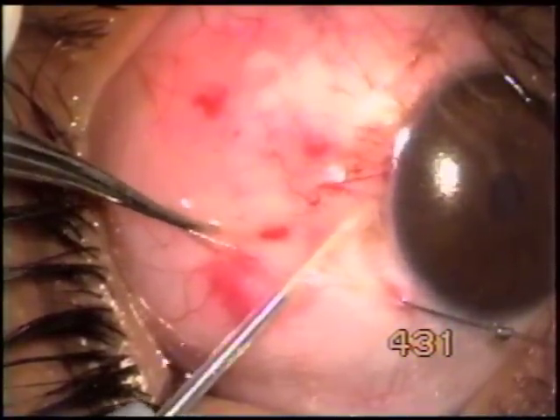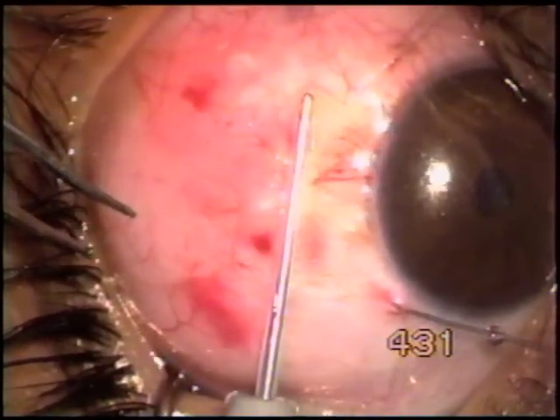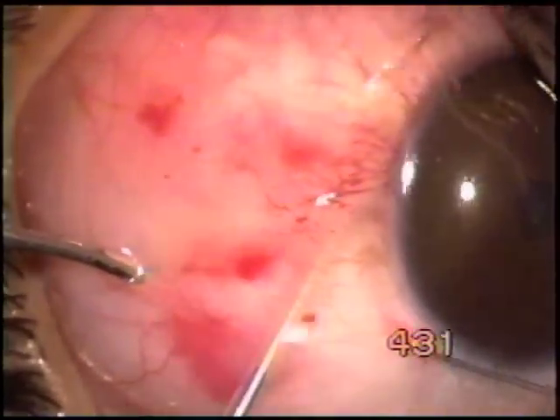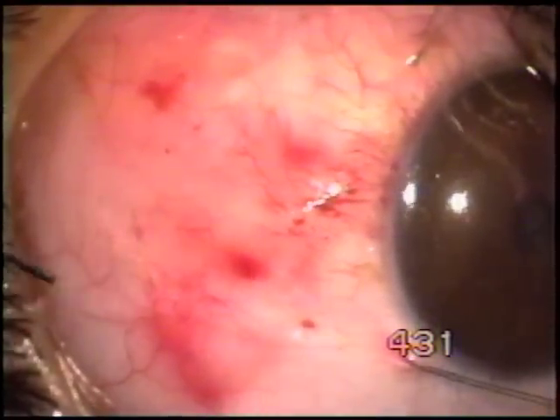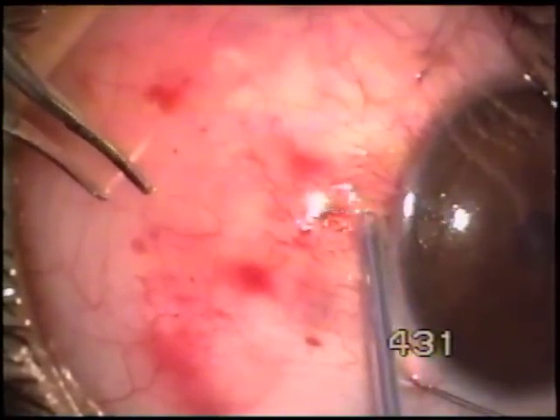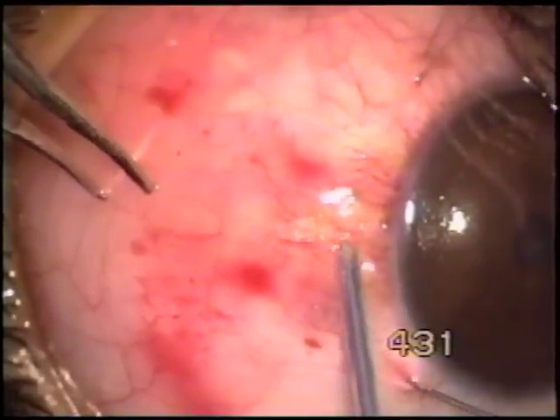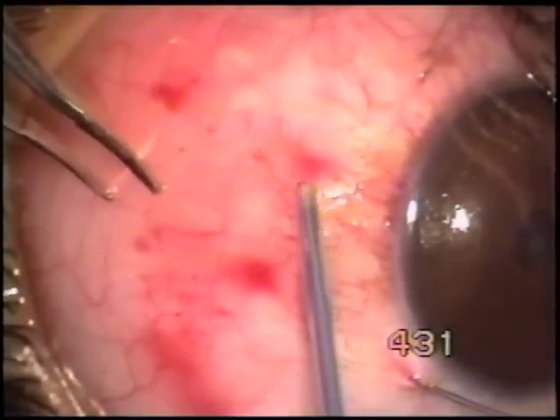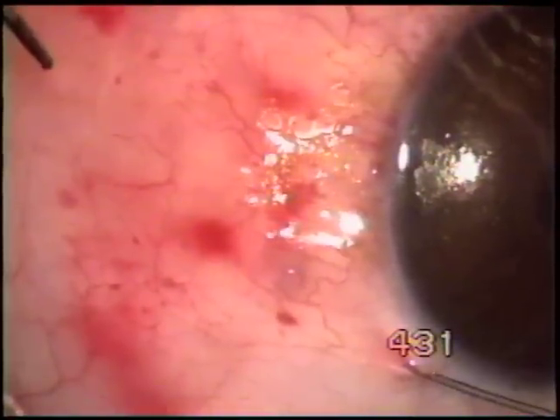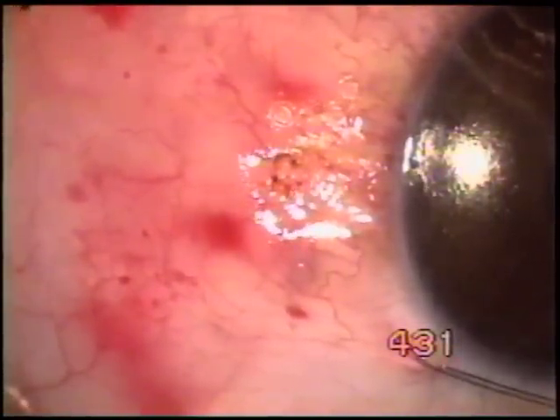Cosmetic result is very important for this patient. As we can see, we have covered quite a bit of ground. I just thought of touching the conjunctiva directly instead of subconjunctival access — touching directly over the blood vessels — and one started bleeding. Doesn't matter, we can leave it as such.